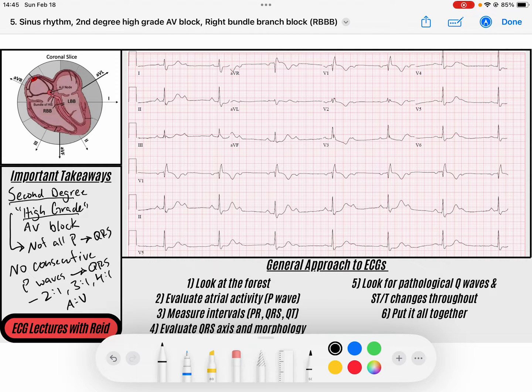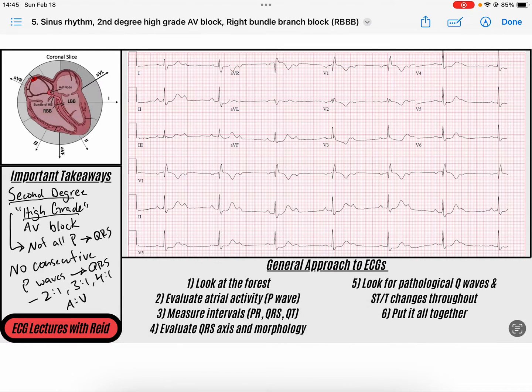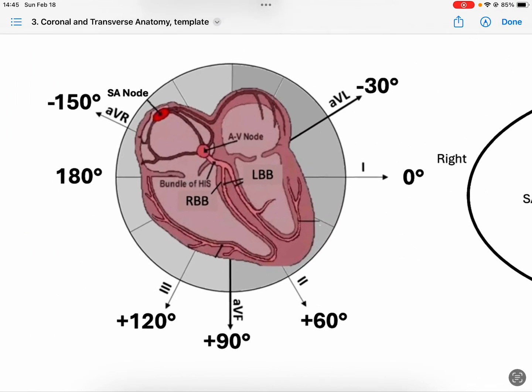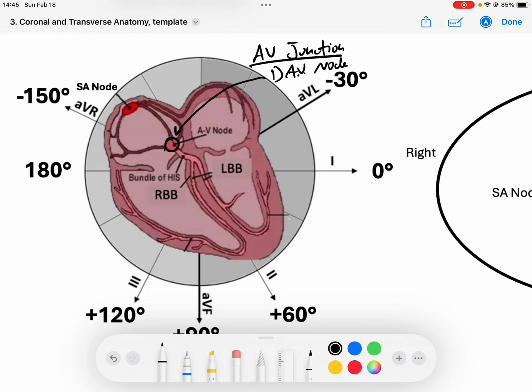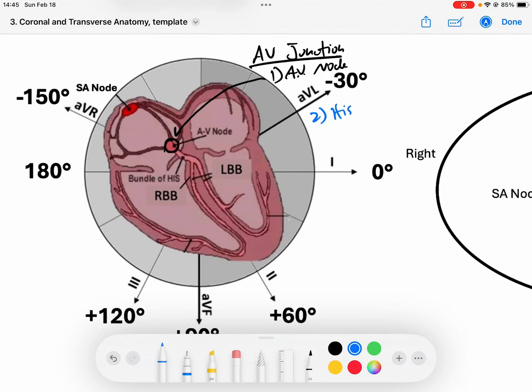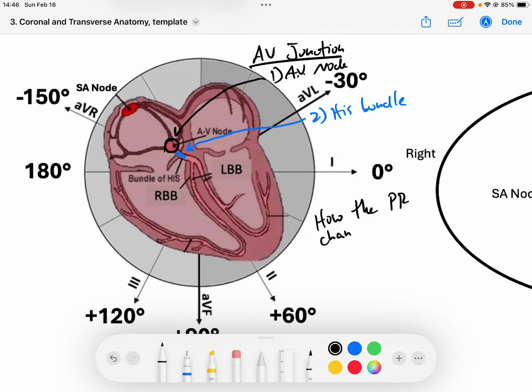These conduction ratios are atria to ventricle ratios. It's really important to delineate this because depending on where the lesion is — either at the AV junction, which is composed of two structures: the AV node proper itself and the His bundle, a short fiber that exits from the AV node — we can tell what type of AV block we have based on how the PR interval changes with each beat.